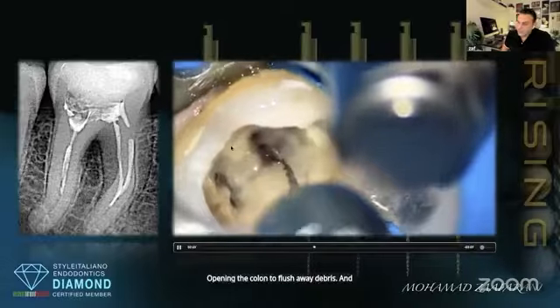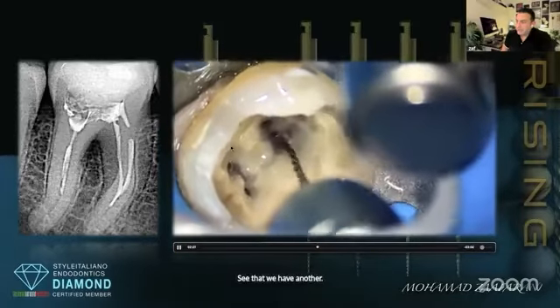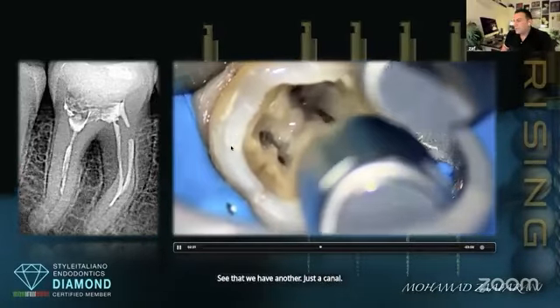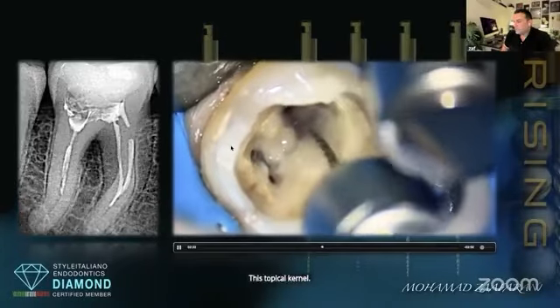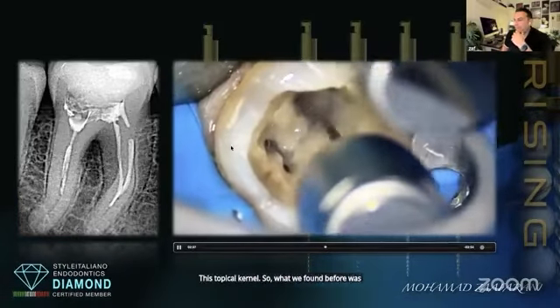And yes, here we can see that we have another distal canal, the distal buccal canal. So what we found before was a middle distal canal.